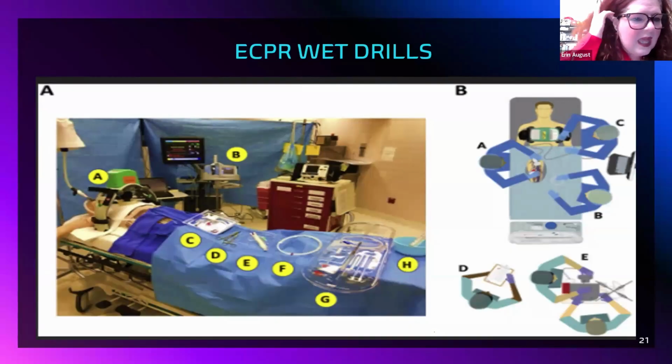ECPR drills are a wet lab of their own. Why? Because this is really a great platform for you to have your entire ICU team. The Alfred in Melbourne, Australia, is fabulous at doing these types of things. I have included them on my resource slide for you. They have a multitude of great things online that you can use as resources as you build out your wet labs and your scenarios.